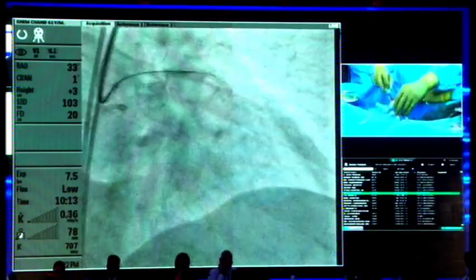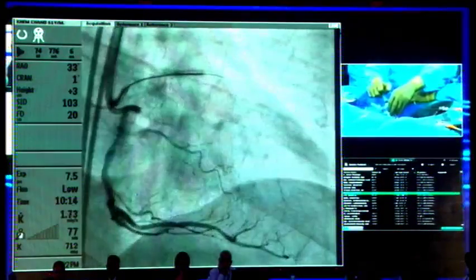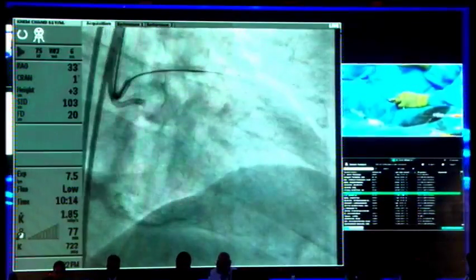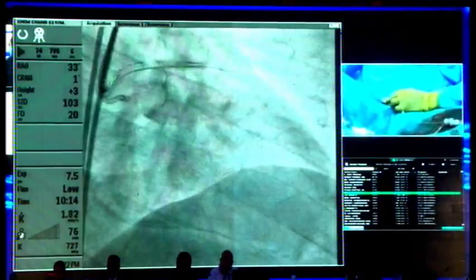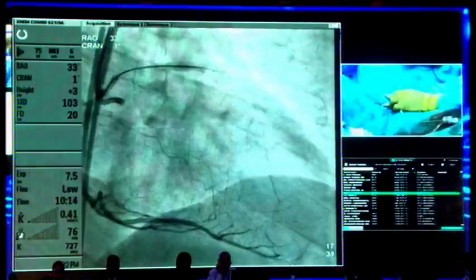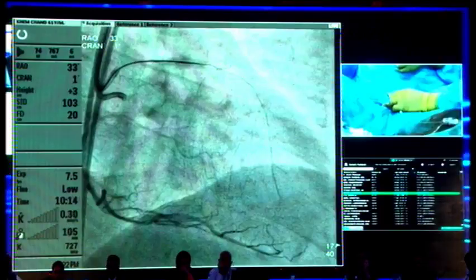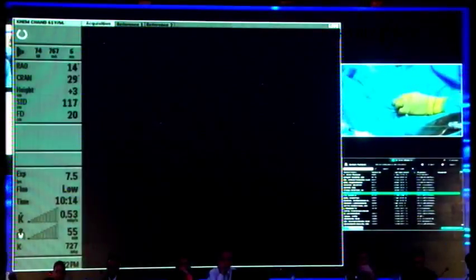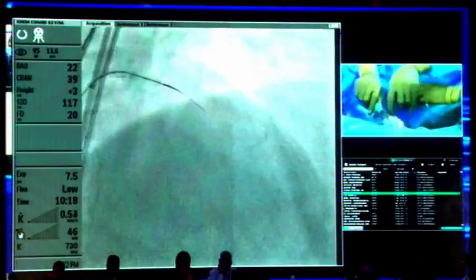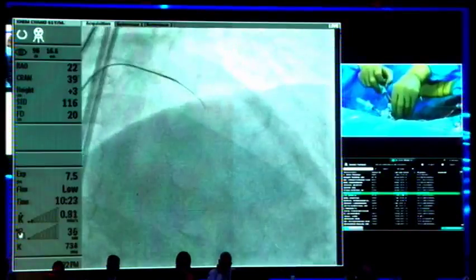Yeah, please. So one more injection to see whether we can go into the distal target segment or not. And there seems to be some branch at the wire tip. Yes, probably we need to go into the branch now. So go into the cranial, please. So we went into some septal branch, no? This wire also comes in a pre-shaped tip. Test it. No, this is not a branch. Test it. Yeah.